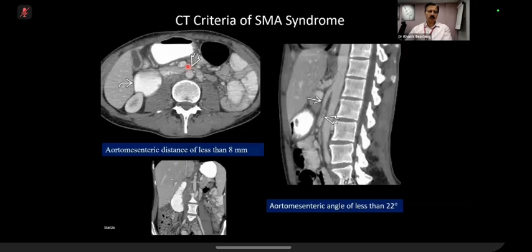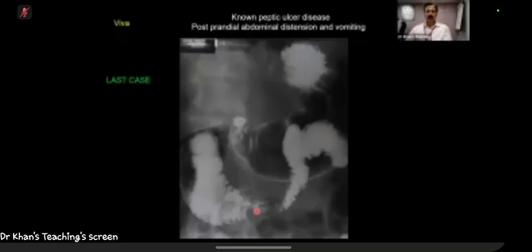to do fluoroscopy, this is what I am telling you is an exam type of answer.